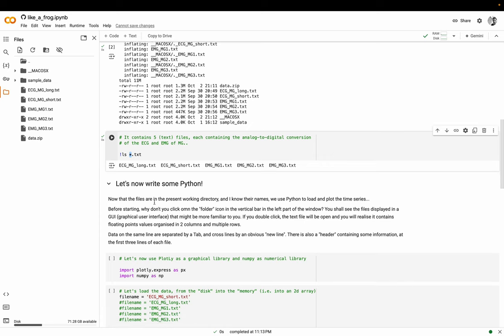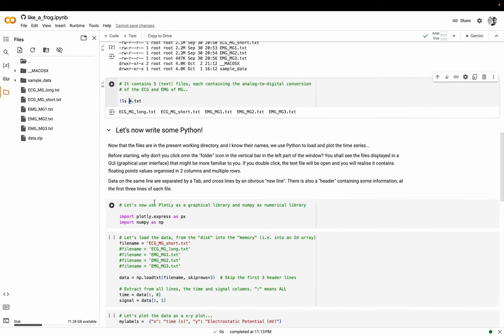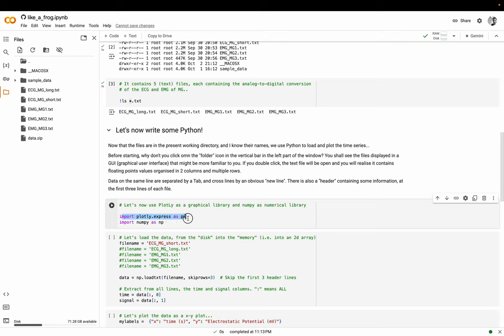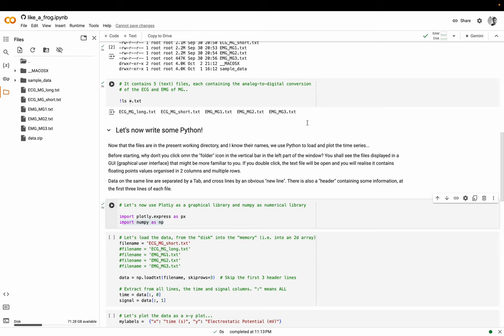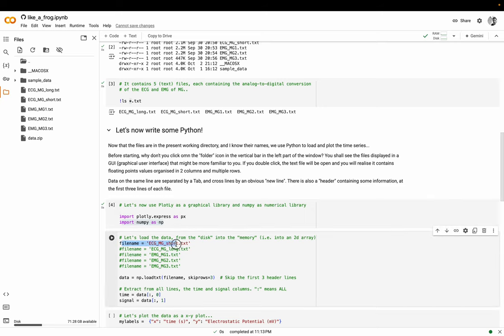Now we write some Python. I wanted to keep it as simple as possible using one library that is plotly express, which is the simplest as possible, and then a library that is a numerical library called numpy. It allows to have numerical operations - mostly here it's used for numerical arrays or vectors. I can click and the execution is almost instantaneous, zero seconds. Here I am setting a string to one of the file names.